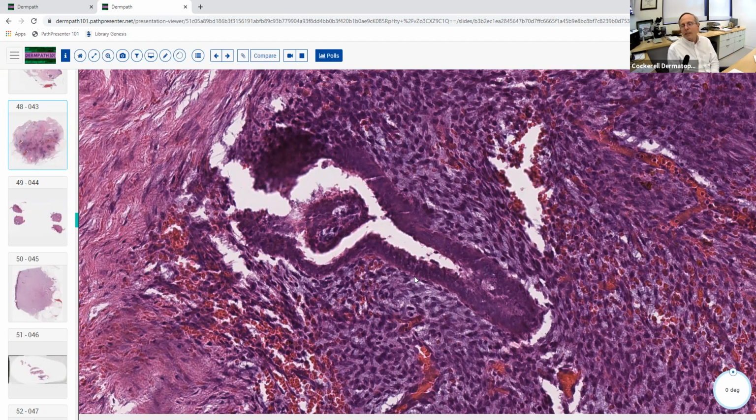I hope you did. That's great. But this is probably not something they're going to ask you on the exam, just so you'll know. But you can kind of work through this. They might ask you about, say, median raphe cyst. They might ask you about cutaneous ciliated cyst. So it's not a bad idea to know some things that could be in the differential diagnosis of that.